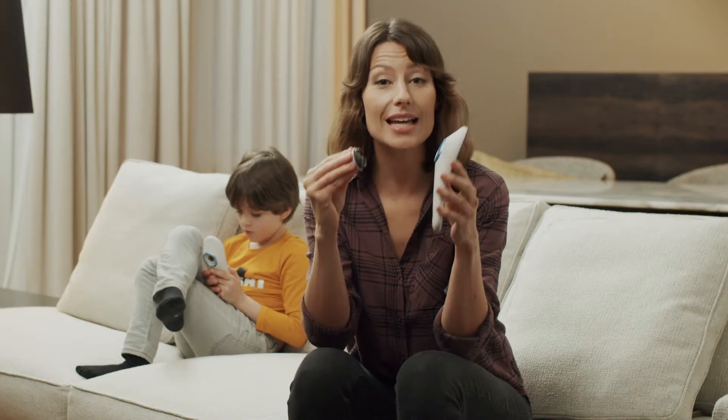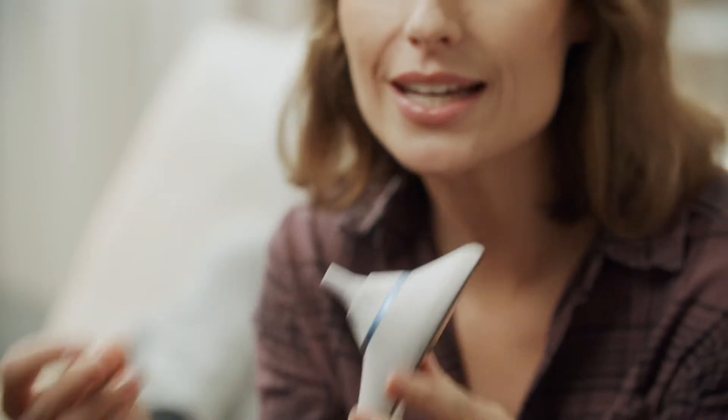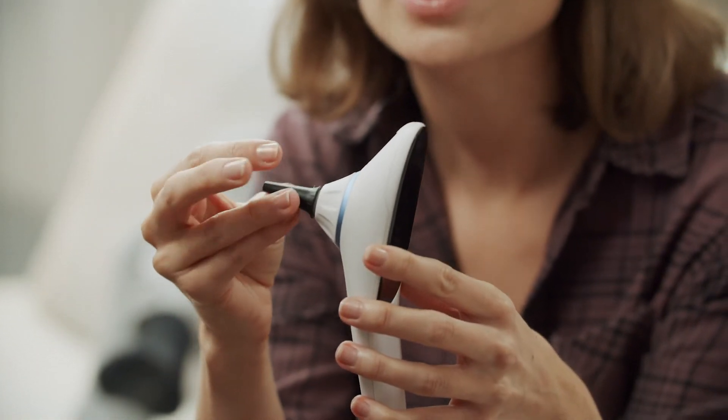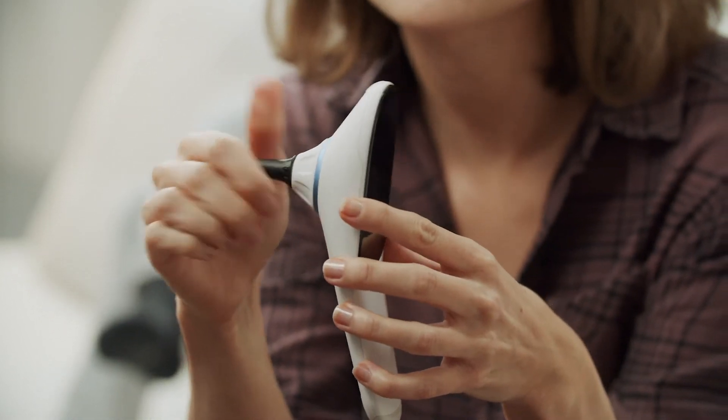To properly perform an ear exam, first prepare your HIGO device. Attach the otoscope module. Next, attach a disposable speculum. Place it on the end of the otoscope and lock it into place, just like a HIGO module. A properly positioned speculum should not move or fall off the otoscope module.